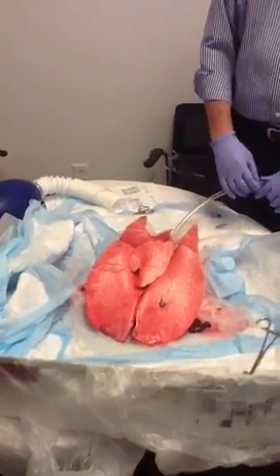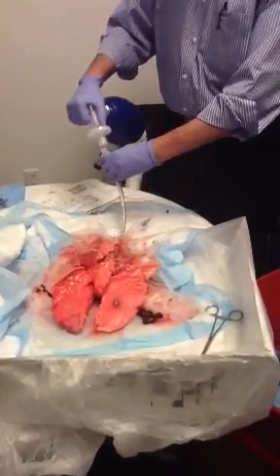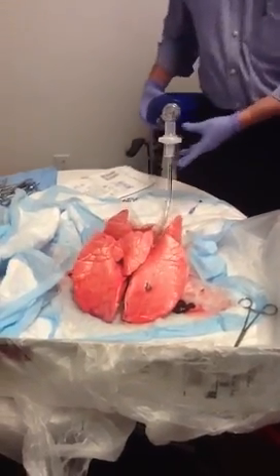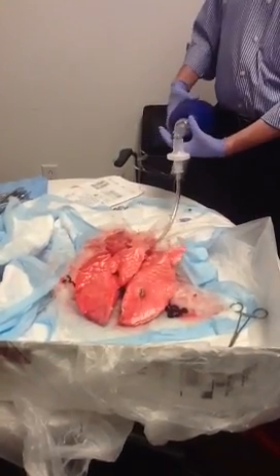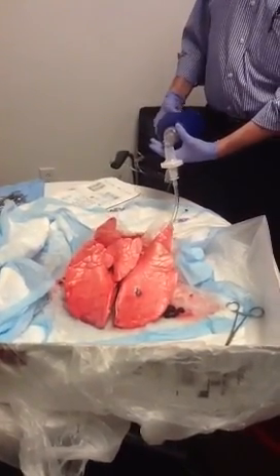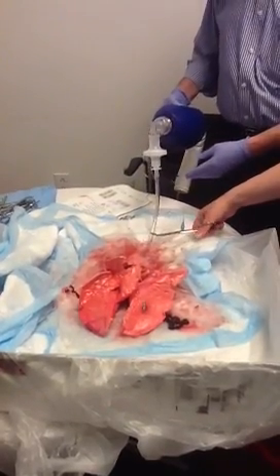I'm going to interrupt the system here and bag this patient with two hands. A shout-out to all the people in cardiothoracic respiratory therapy. We're going to bag with one hand — that's reasonable when somebody's in an emergent state. I can create a little PEEP by creating a threshold resistor here. But I frequently see people bagging with two hands because somebody has an obstruction. Margaret and Denise here will help recreate an obstruction just by clamping a little bit.